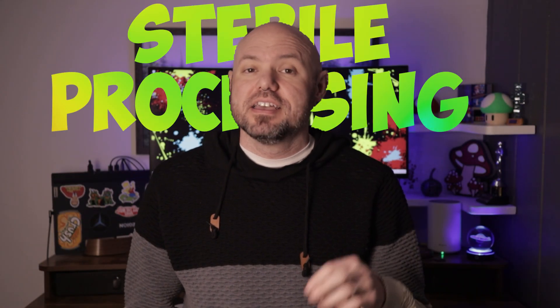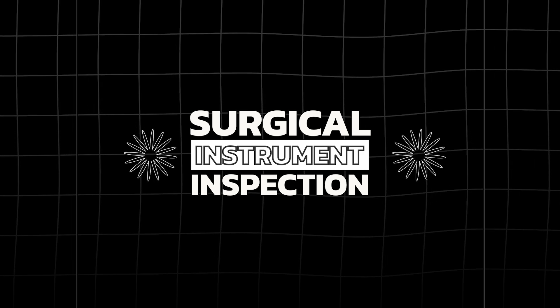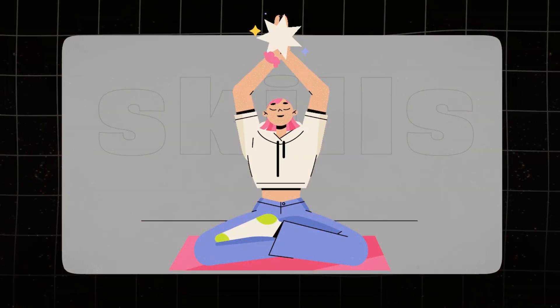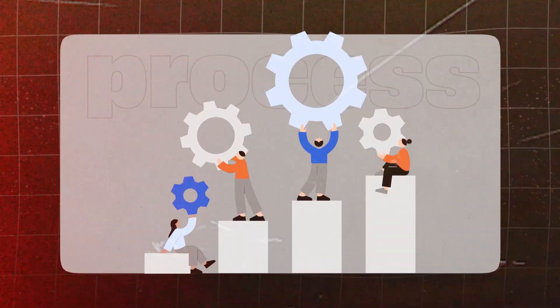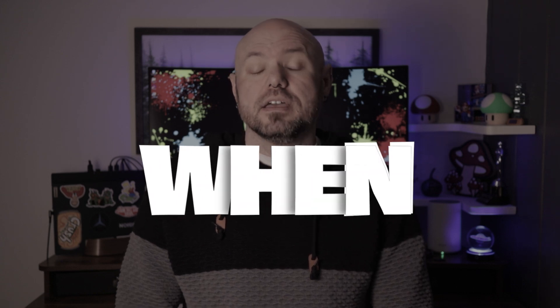Welcome back to the channel that takes the mystery out of sterile processing. I'm Brandon the Sterile Guy and today we're focusing on a cornerstone of patient safety: surgical instrument inspection. Whether you're studying for certification, enhancing your skills, or looking to improve your department's processes, this video will guide you through the how, what, and when of instrument inspection. Let's get started.